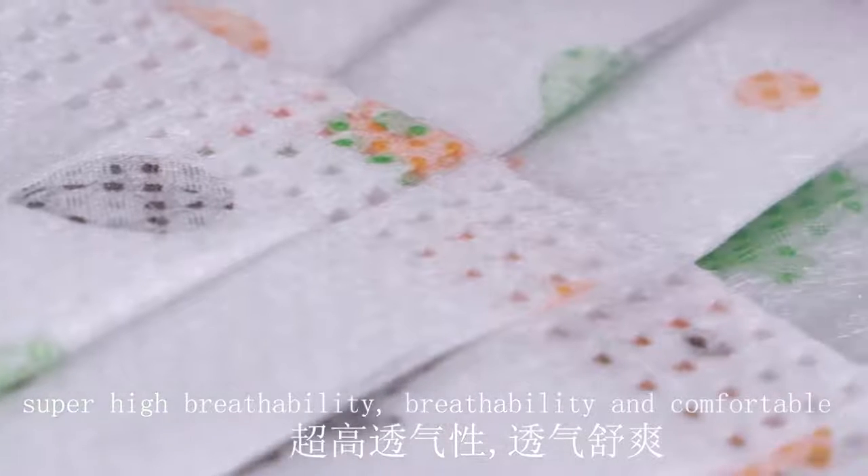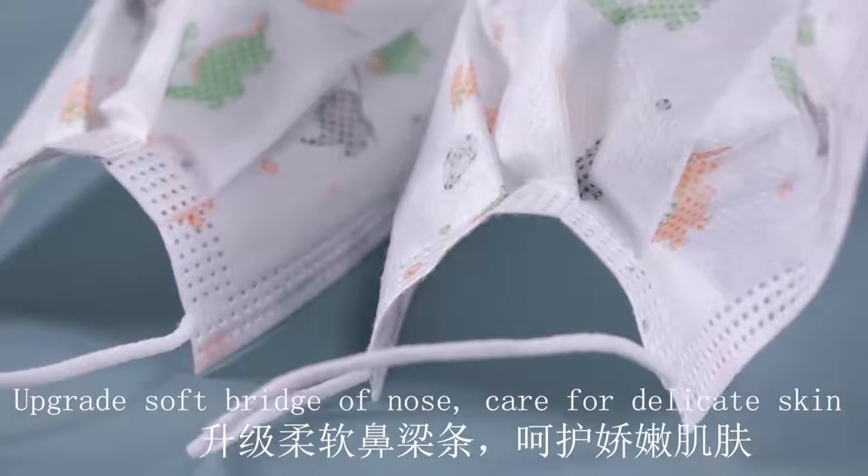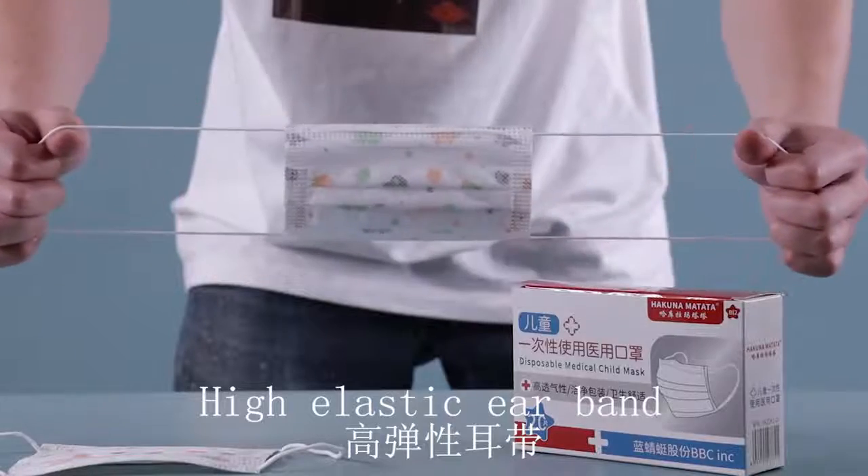It's three-layer barrier protection: the dust-proof and breathable fabric, and melt-blown fabric design, to effectively block droplets, dust, and smog.